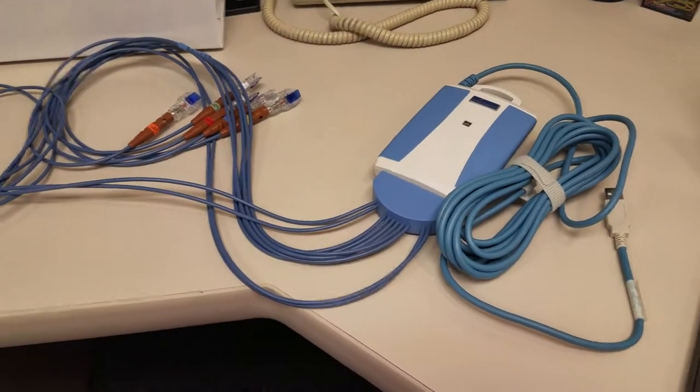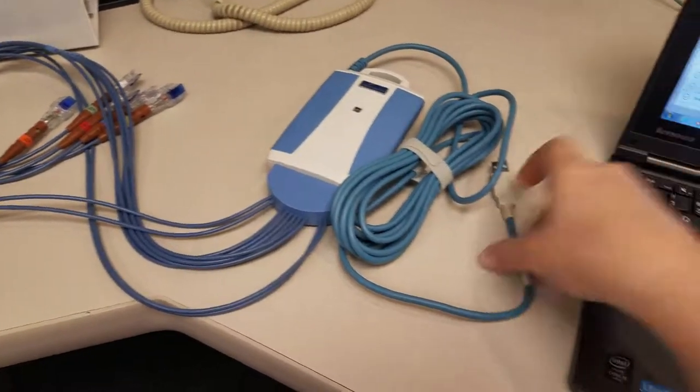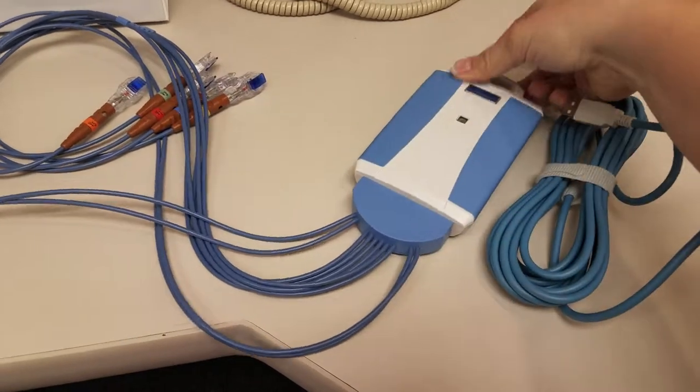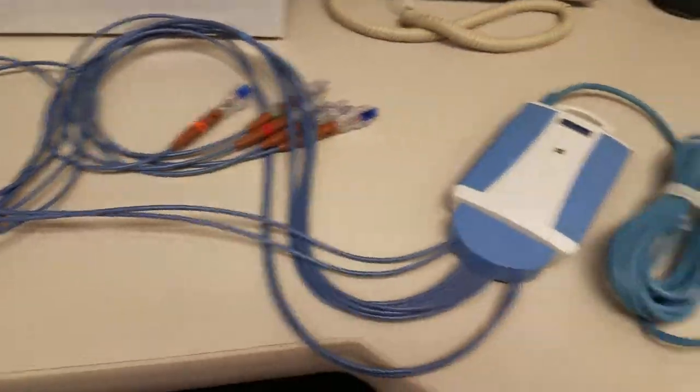Hi guys, this is an overview of our new Midmark EKG machine. It is portable. Here's the base unit and then the probes.